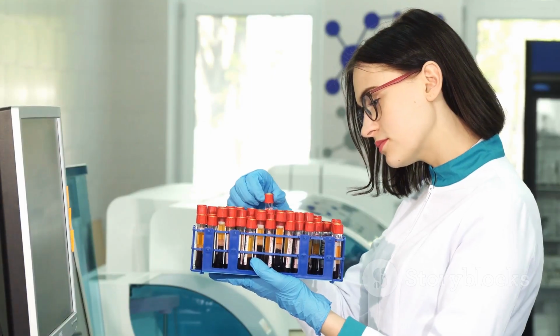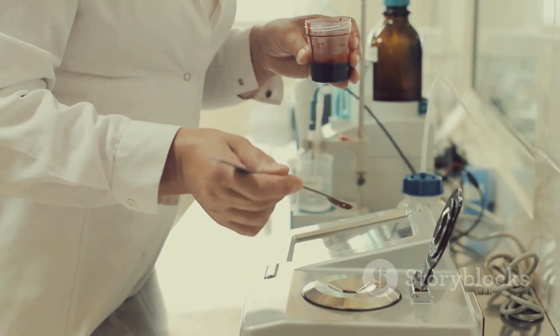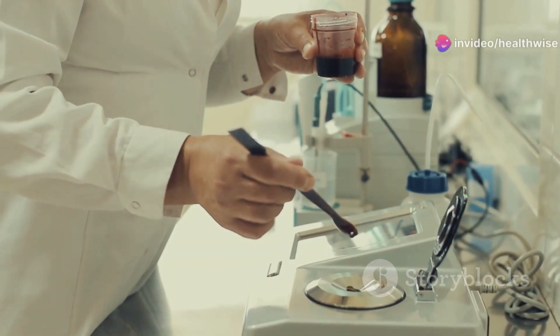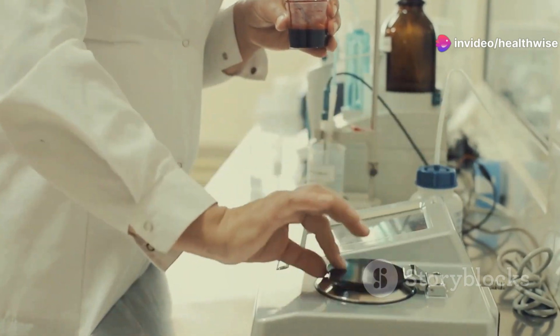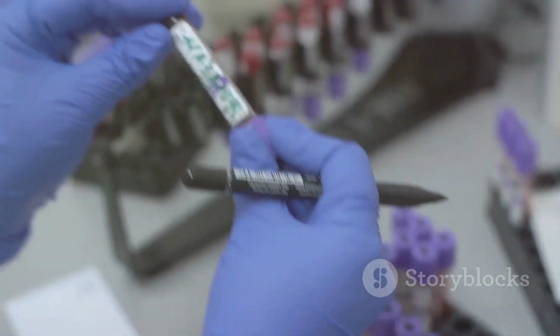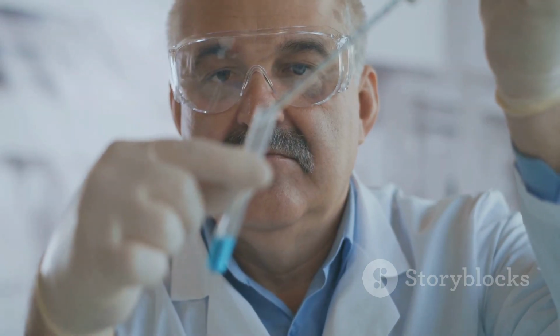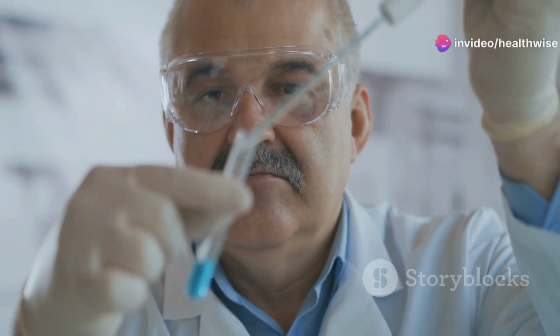This method is based on a colorimetric principle. Here's how it goes. Add 2 milliliters of 10% trichloroacetic acid to 2 milliliters of CSF. Mix well and let it stand for 5 minutes. Centrifuge at high speed and discard the supernatant. Mark this tube as test. In another tube marked blank, add 1 milliliter of 15% NaOH to both tubes.